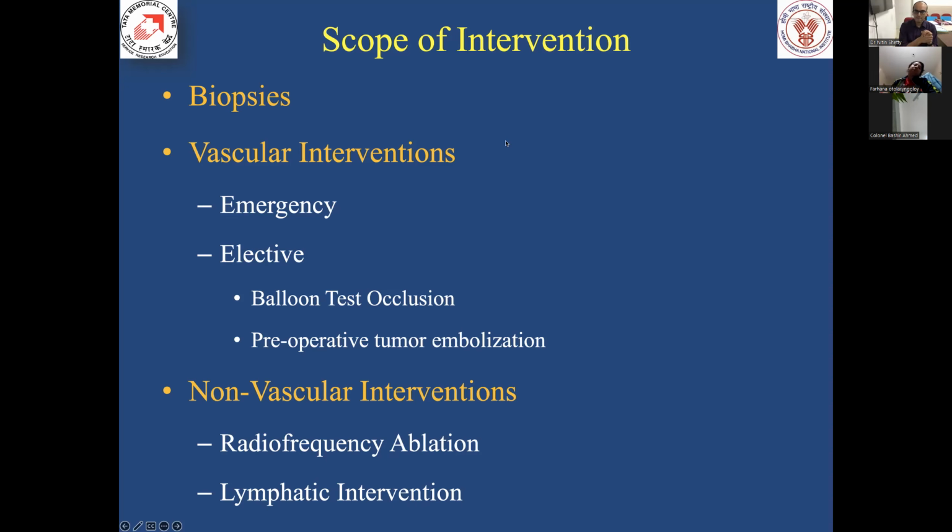So here I would say, Dr. Nitin, that because we are talking mainly about lesions which are less than 1 centimeter, mostly a single nodule, not multiple nodules, if the RFA is providing proper treatment, I don't think we need to go for radioiodine. As per the ATA guidelines also, for a single nodule less than 1 centimeter, active surveillance is an important part. And we are giving treatment in the form of RFA, and it is showing with contrast ultrasound or MRI that there is no lesion after 6 months or it is stable. I think we need not give radioiodine.